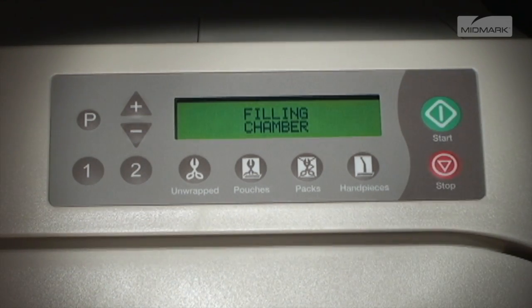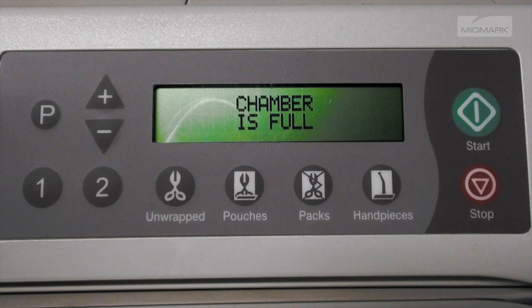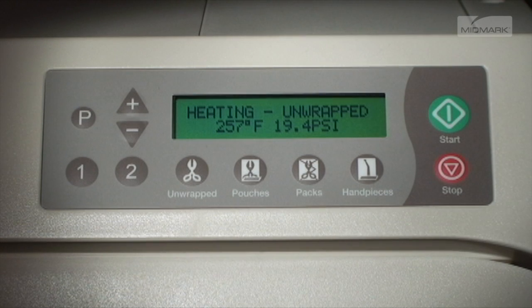Next, push the Start button. The display immediately shows the message Filling Chamber, followed by Chamber is Full when the proper water level is reached. Now the unit will begin to heat to the appropriate temperature for the cycle being used. The display changes as temperature and pressure in the chamber changes.